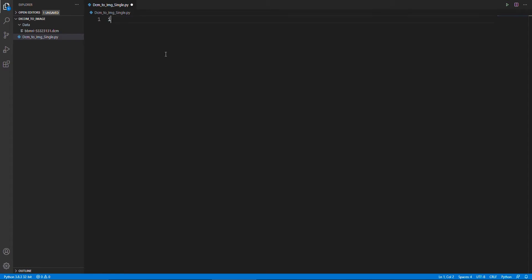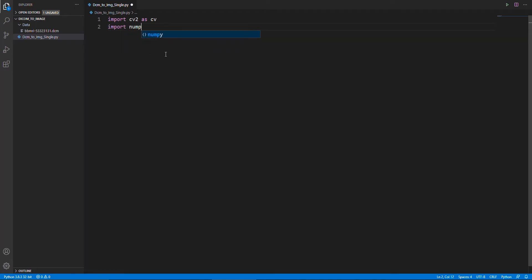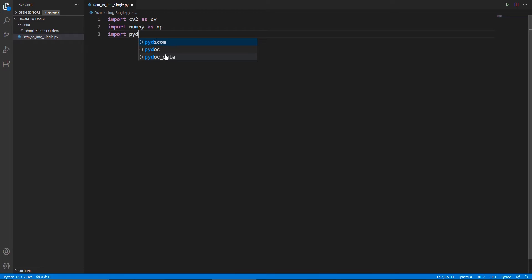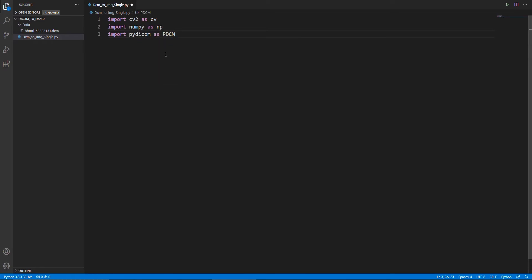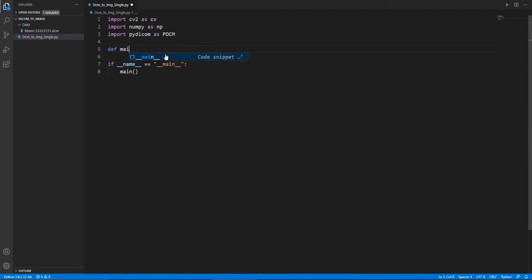First of all we will add all the required libraries to process our file. Generally a DICOM file is a 16-bit image which is not usually readable by the image viewer. Our goal is to convert this 16-bit file into an 8-bit image which is easily readable by an image viewer. Furthermore, image processing algorithms can also be applied to this 8-bit image.